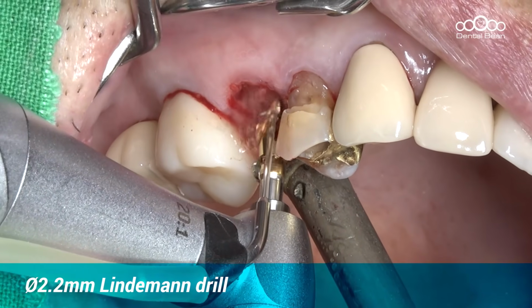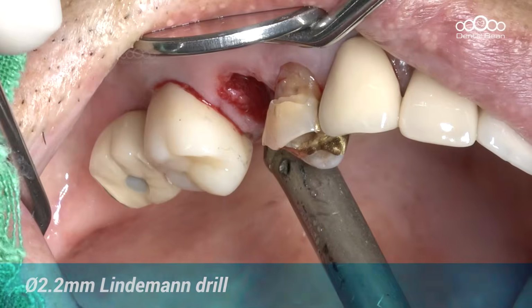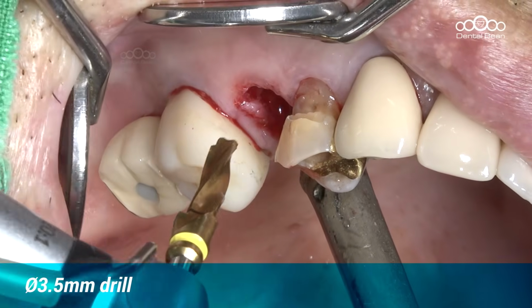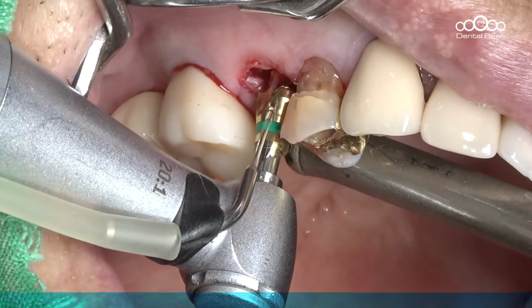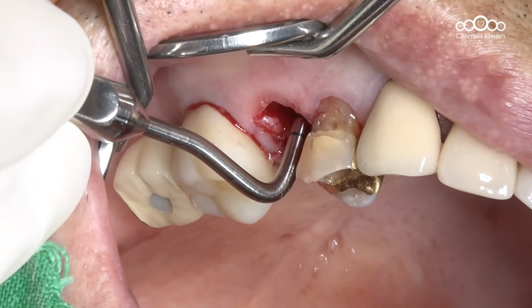Now, through drilling, a notch is being created in the root apex area. And drilling is continued through that area to check whether the sinus membrane can be felt. After additional drilling, a perforation-like sensation was felt once again, and the membrane was explored again in that area.